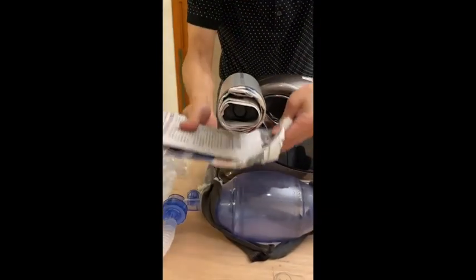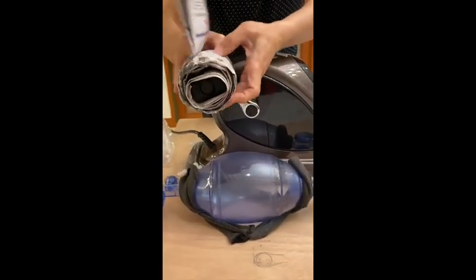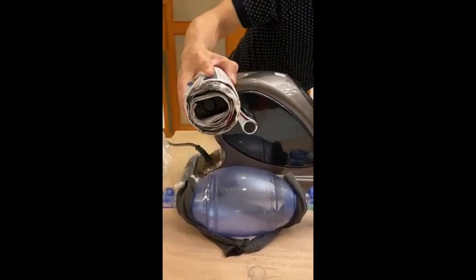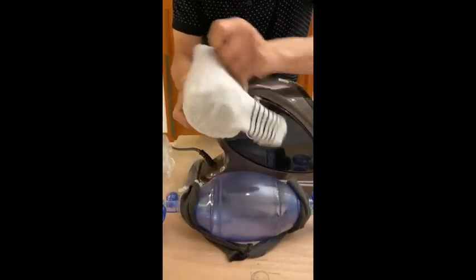More newspaper to adjust and enlarge the diameter, and then socks to hold the newspaper together.